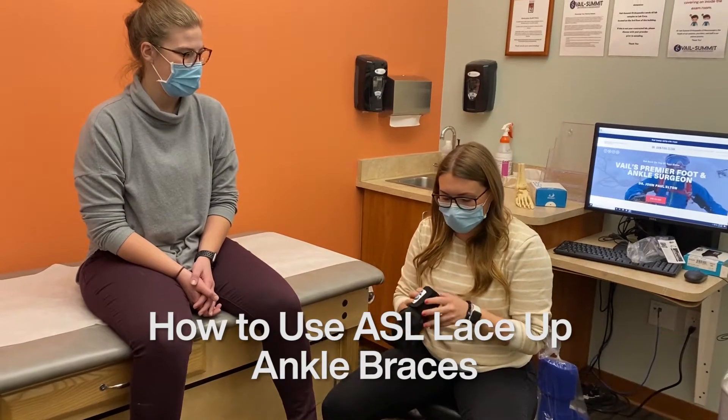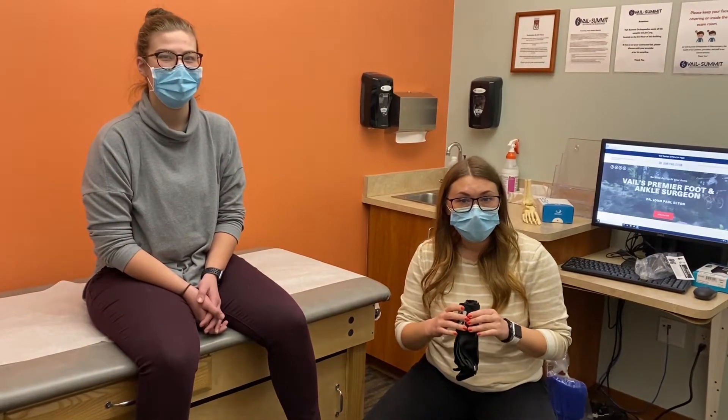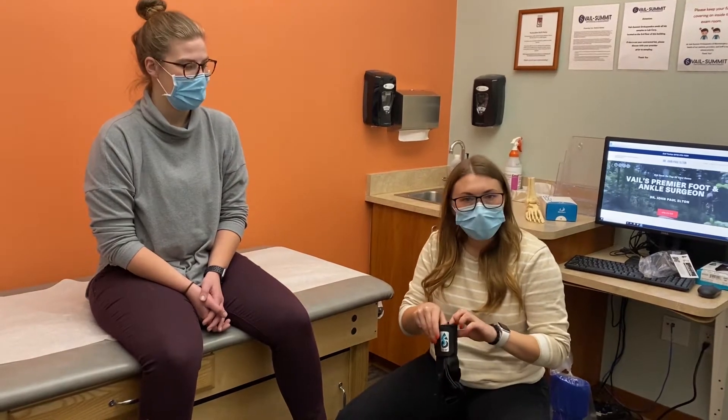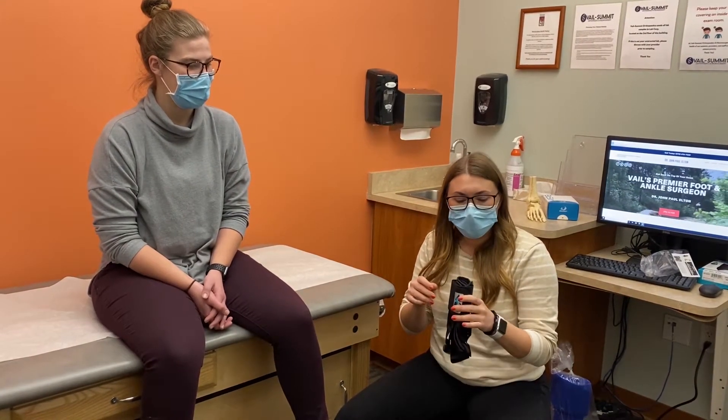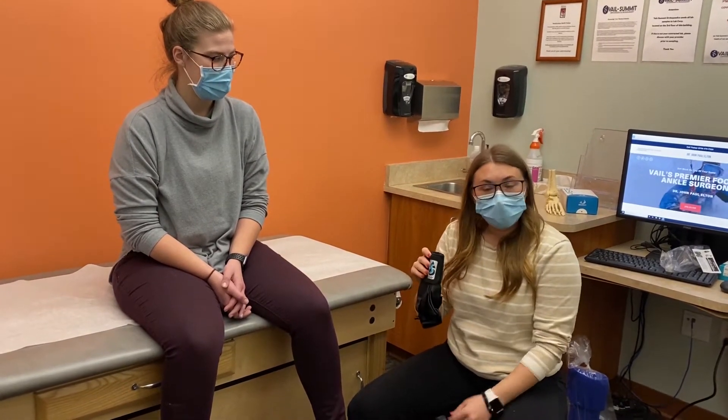These are typically used if you're transitioning out of a boot after a fracture or an ankle sprain, usually with activity, but we do have a tendency of keeping you in these a little longer as you start to wean out of your boot. So we're going to give you a little how-to instruction.